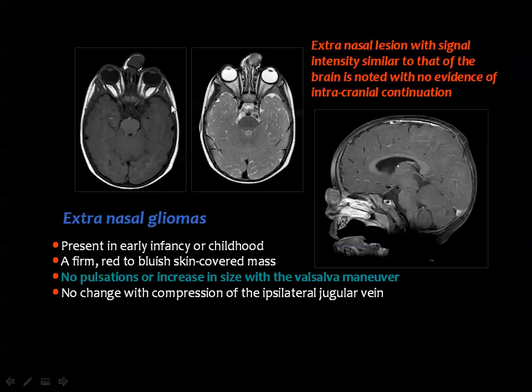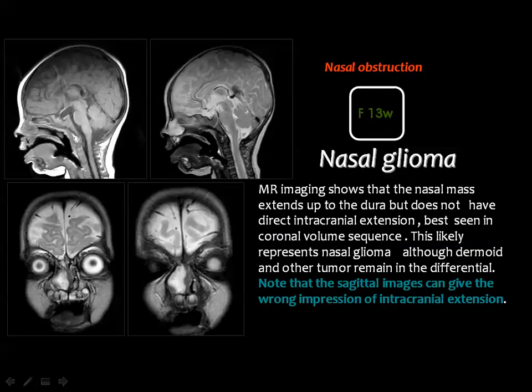This is an extranasal glioma: you see the mass at the root of the nose with intact calvarium and no connection between the lesion and brain tissue. However, in this particular pathologically proven nasal glioma, the sagittal images may suggest intracranial continuity, hence the importance of coronal images. The coronal images confirm the lesion inside the nose with no connection to brain tissue.